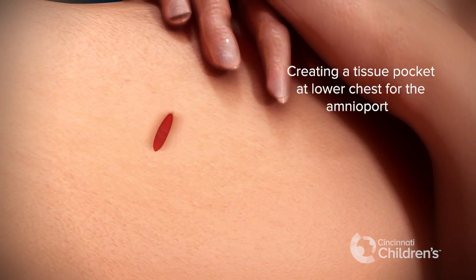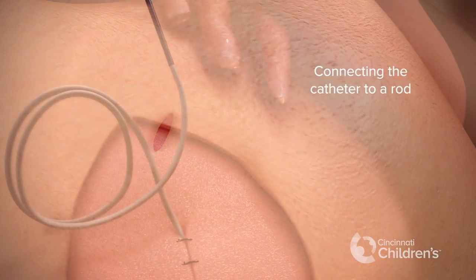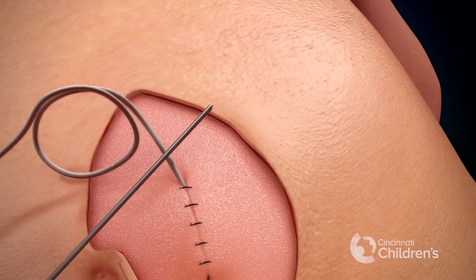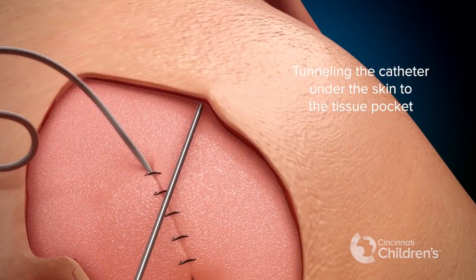The next step is to create a tissue pocket on the lower chest wall of the mother. We then connect the catheter to a tunneling rod, and the catheter is tunneled under the mother's skin to the tissue pocket on the chest wall.